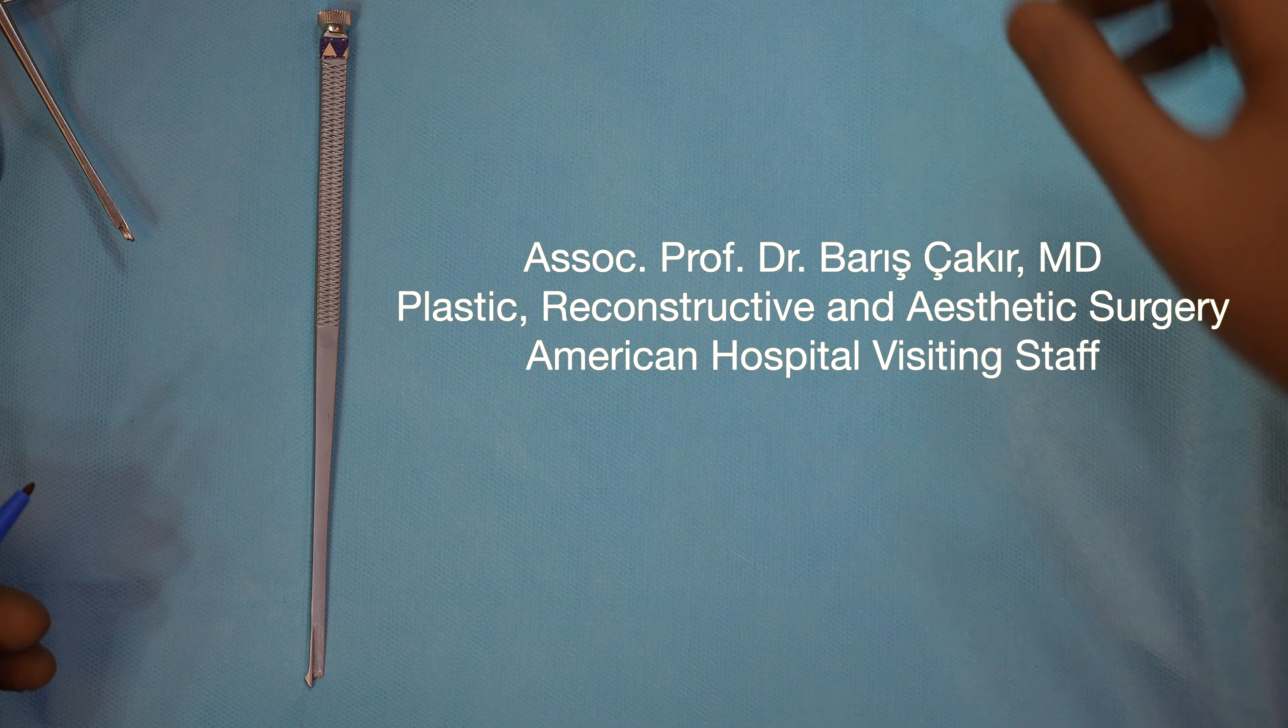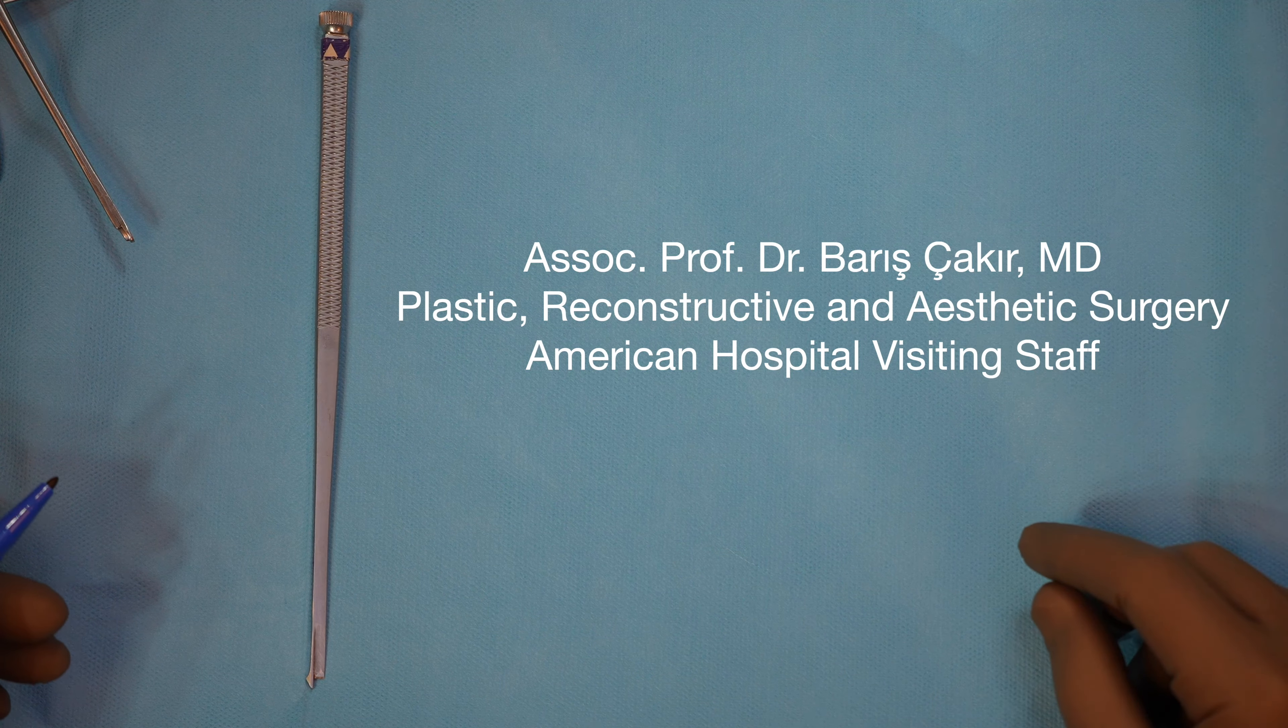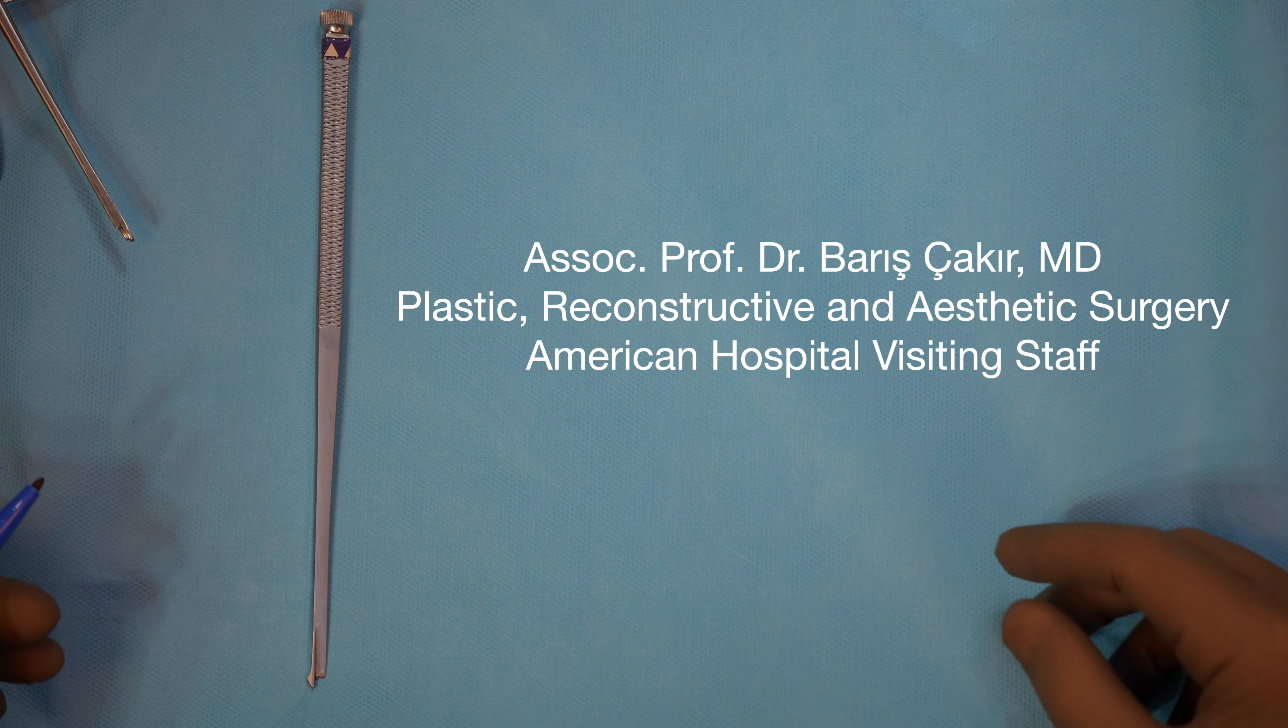Hi everyone, I'm Baris Çakır. I want to talk about my favorite rhinoplasty instruments.